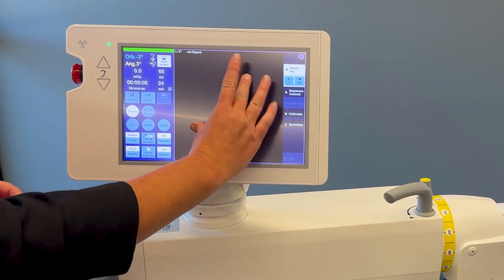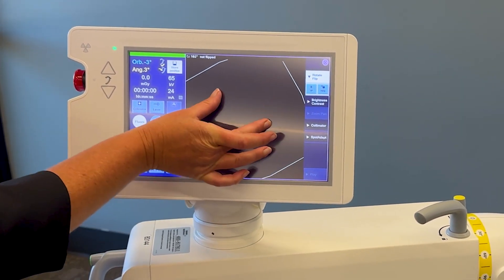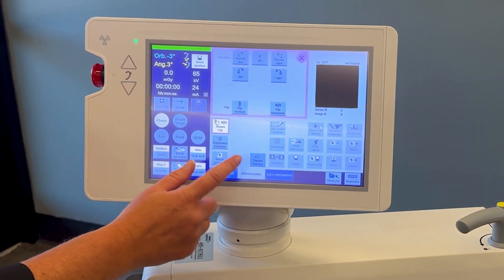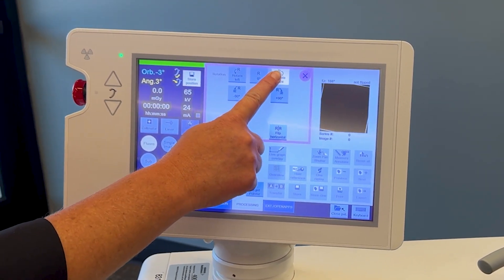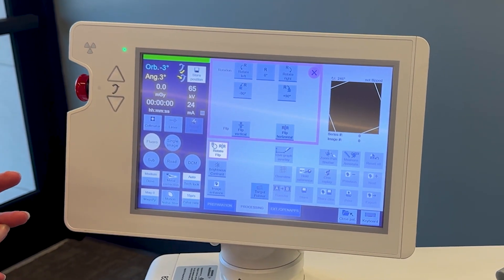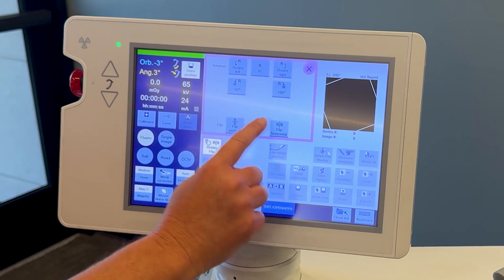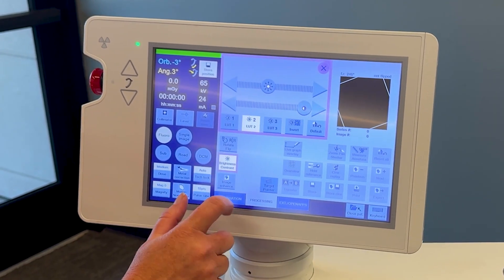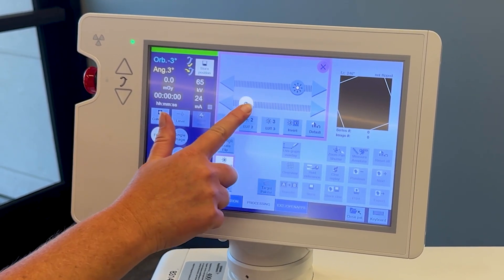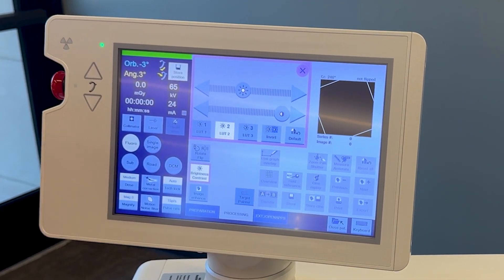You can even rotate your image from the touch of your fingers. Ours is a true flat detector technology, so your image will always stay a square. Brightness and contrast — you have the ability to use the toggle switch or you have three lookup tables to toggle through.